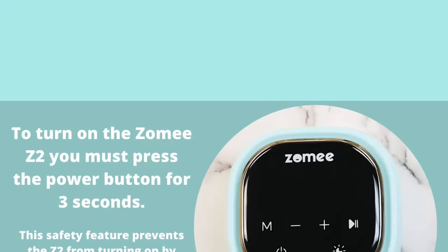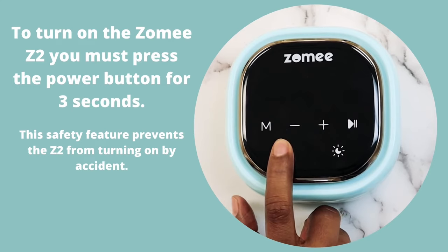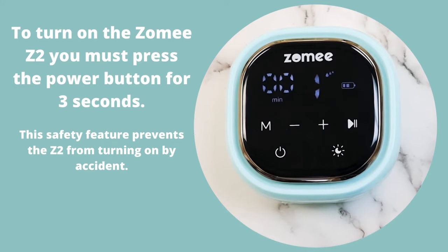Starting to Pump. To turn on the Z2 Pump, you must press the power button for 3 seconds.